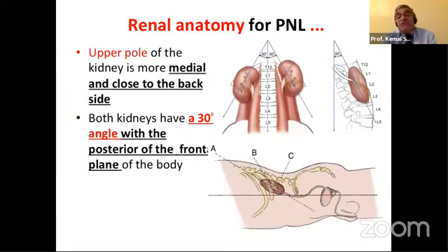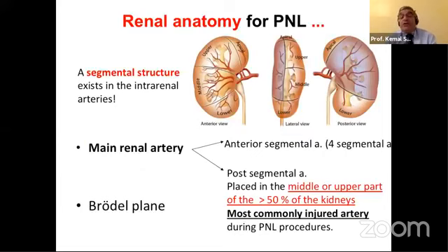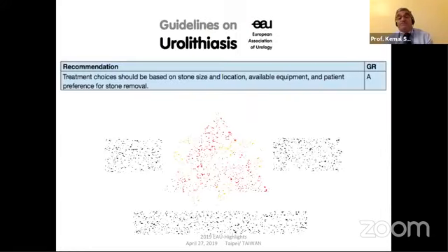That means we and the young generation that are being trained now need to have sonographic experience to puncture the kidney. Renal anatomy is very important. We need to know its location, its proximity to other structures, angles, and also the adjacent organs. Calyceal anatomy is very important, and this may differ from one patient to the other. We need to evaluate the calyceal anatomy by retrograde evaluation just in the beginning, if we have any suspicion or any problem coming from the sonography or CT evaluation. And also the renal vascular anatomy, we must know it very well: main renal arteries, their segmental distribution, Brodel's line. That's why, as Christian told us, a perfect puncture through the papilla directly into the relevant calyx, in a direct alignment up to the stone, will be very important.